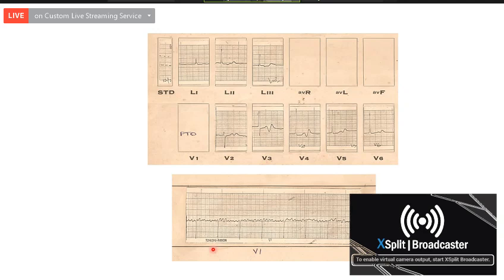So you also found that the patient is having a prominent U wave. What else? There is a biphasic T in V3. Part of it may be the U wave. The U wave may be prominent. When will you say that the U wave is abnormal? If it's more than the amplitude of the T wave?